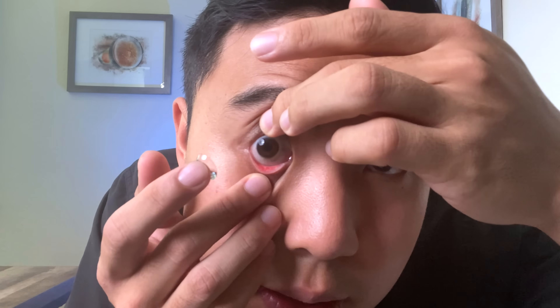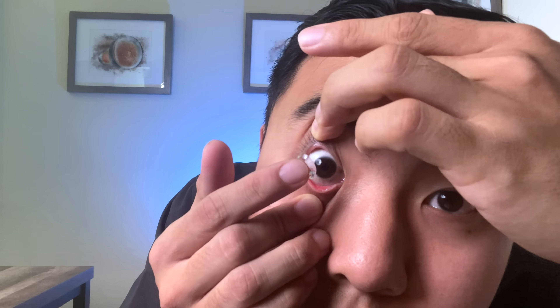But if you turn your head a little bit to the side, you're actually going to be putting in the contact lens on the side of your cornea, which is a lot less sensitive. So I'm going to open my eyes, turn my head a little bit to the right, put in the contact lens on the side of my cornea, and then turn straight — and now it's in. That's the magic move: turn your head to the side, put the contact lens on the side of your eye, then turn straight so the contact lens centers over your eye, and you're done.